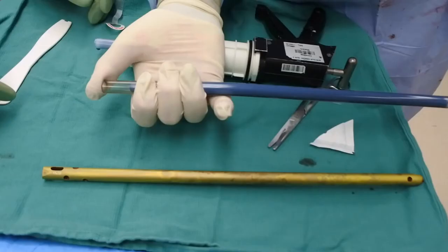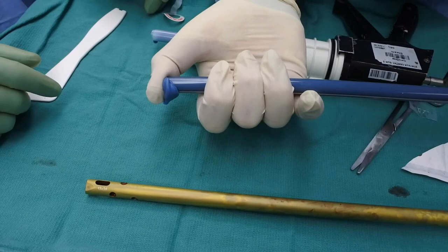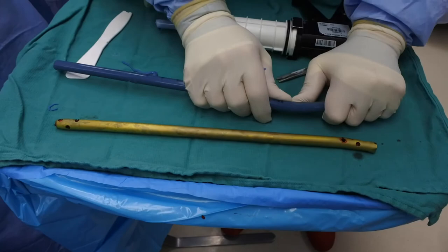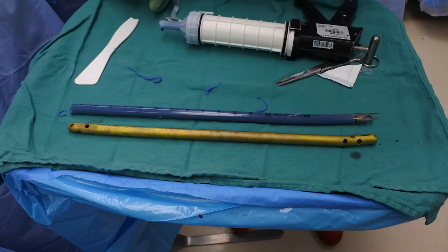In order to create a tibial nail we follow the same steps as for a femoral nail. The only difference is the bend that we will place in the nail. Now we're going to come to the middle — here's our nail — and now we have an antibiotic nail that mimics a tibial nail. The only thing left to do now is allow the cement to harden and cut the nail out of the chest tube.